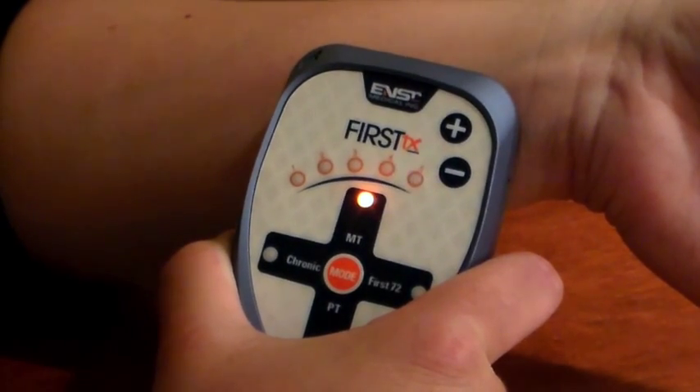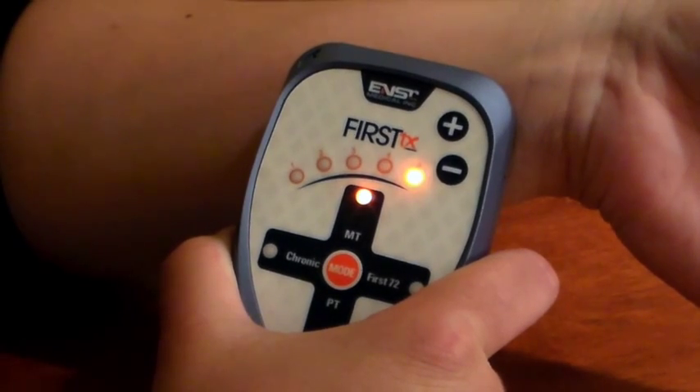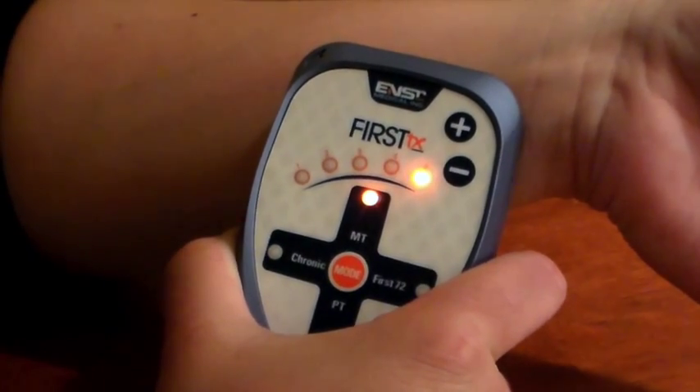That light and that beep is a marker of increments of time and does not indicate that the treatment has been administered.